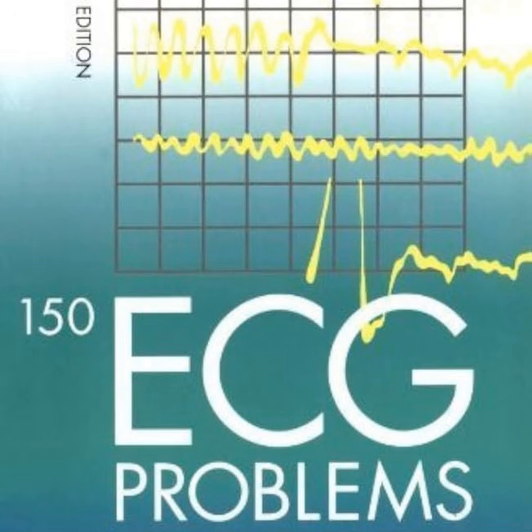That's fascinating. So the practical clinical application for you listening to this is all in the history taking. You see the sagging ST segments, you spot the U waves. You need to immediately ask the patient about their appetite. Yes. The text specifically notes that the very earliest symptom of digoxin toxicity is anorexia, just a total loss of appetite, followed pretty closely by nausea and vomiting. You obviously verify that with serum digoxin and potassium levels, but the ECG basically just handed you the entire physiological narrative.